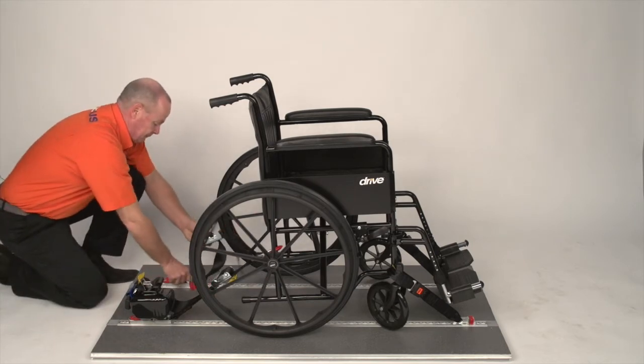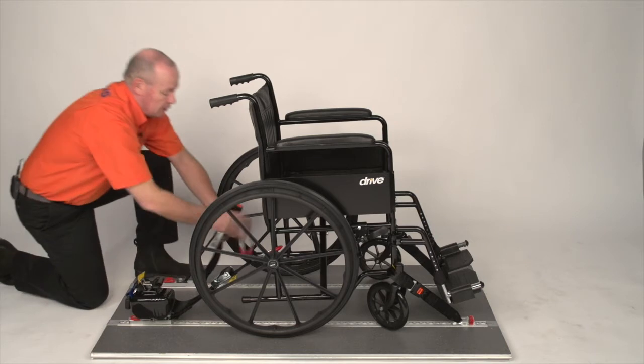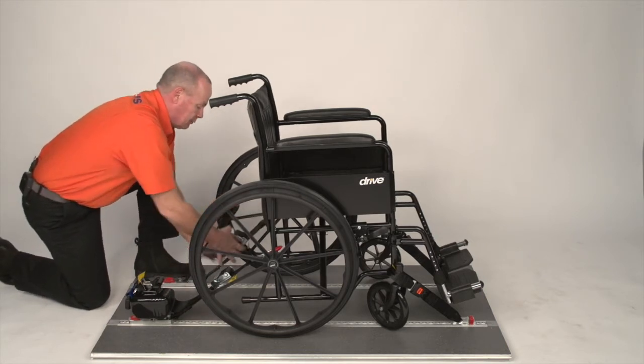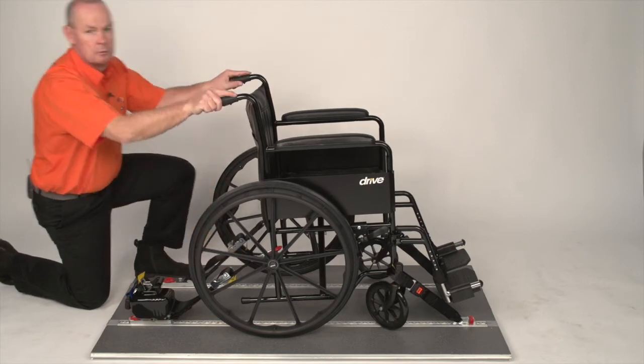Do the same for the other side: open the buckle, attach the hook, pull down tight. The wheelchair is now secured.